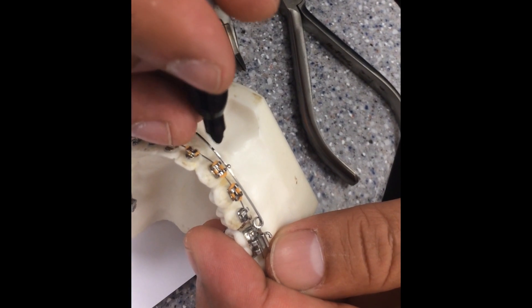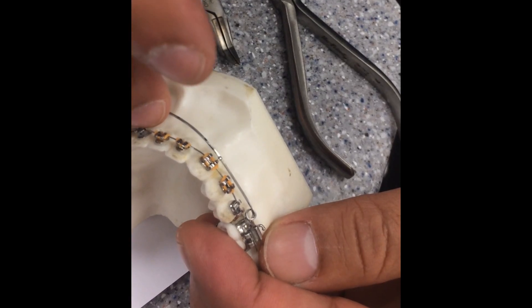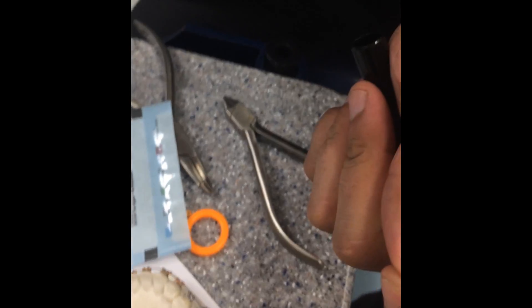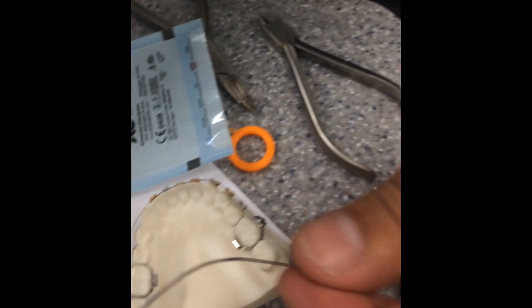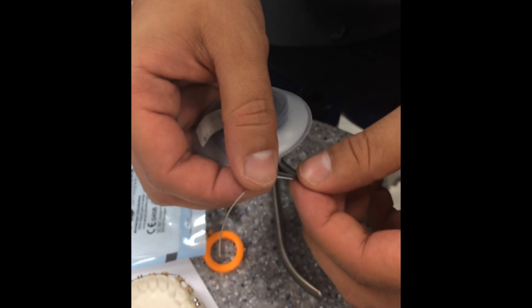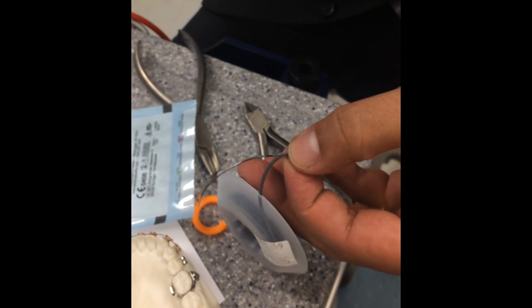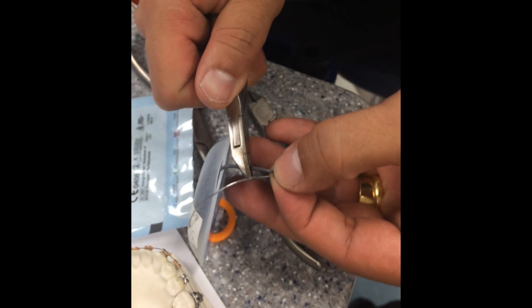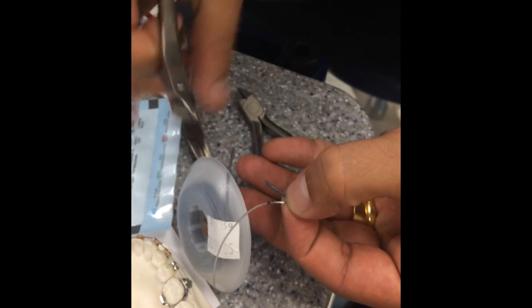And then you can mark it right in the middle of the space. Now we can go with the tubing. You measure the tube, as I told you, because the patient might feel some discomfort due to the edges of the rectangular wire.